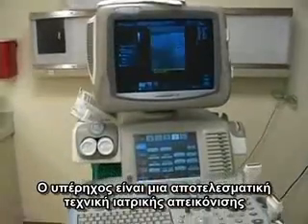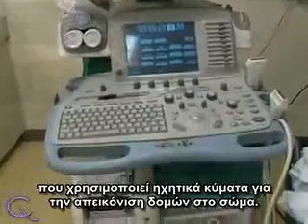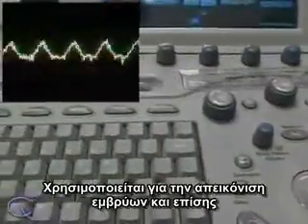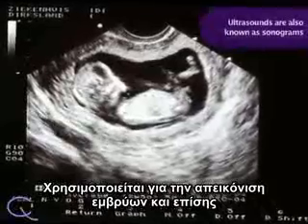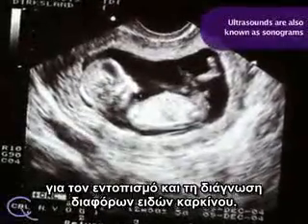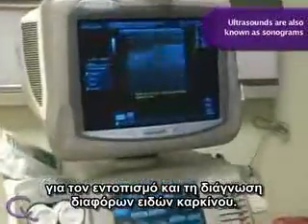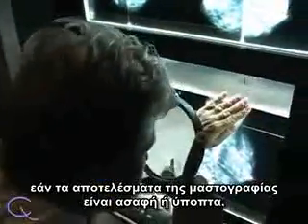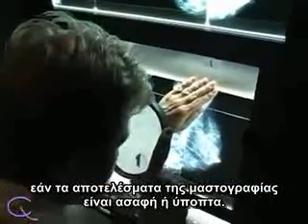An ultrasound is a powerful medical imaging technique that uses sound waves to create images of structures inside the body. It may be used to view a fetus in a pregnant woman, and it can also be used to detect and diagnose different kinds of cancers. Specifically, a doctor may request a breast ultrasound if the results of a mammography exam are unclear or suspicious.